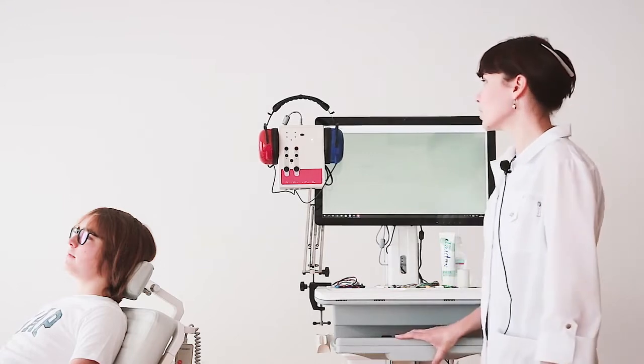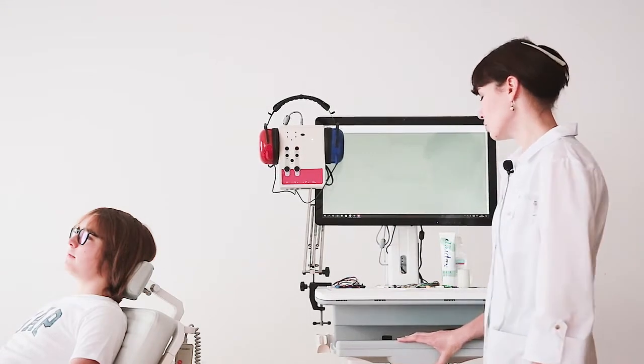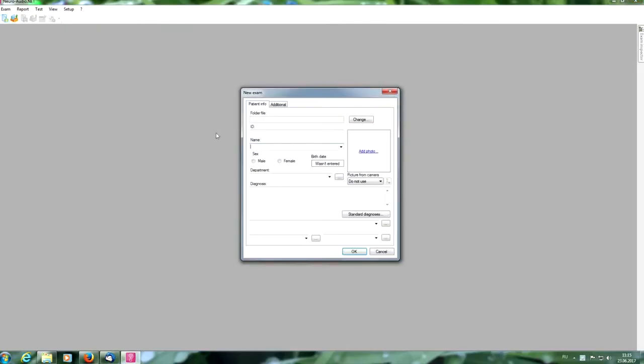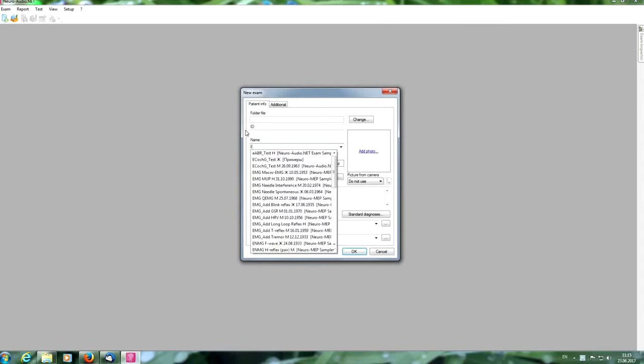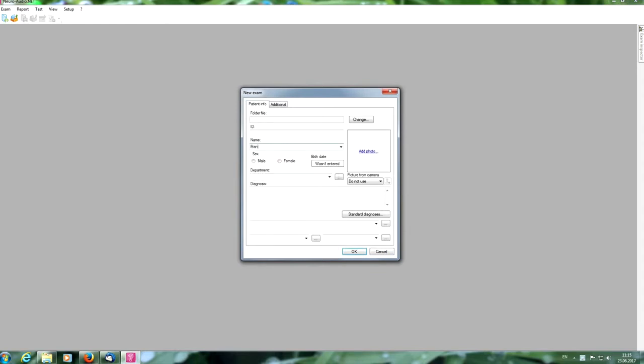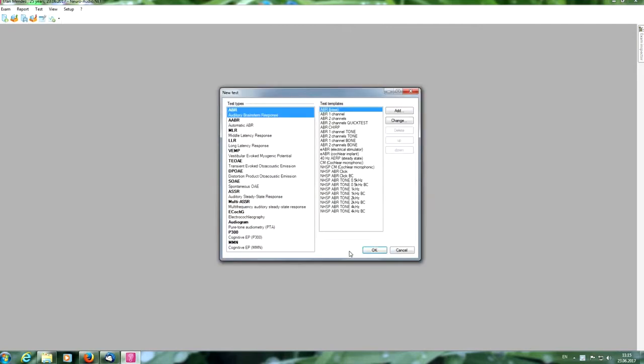Now we can run the neuro audio.net program. Press New Exam button and insert the patient's data: name, sex, and birth date. And press OK button, if enough.